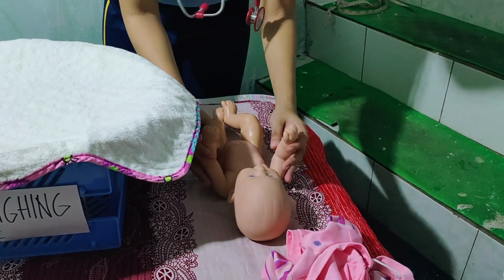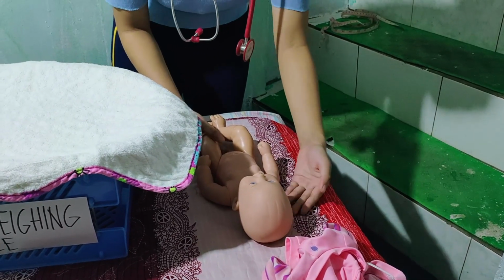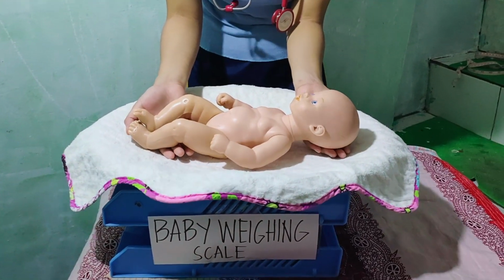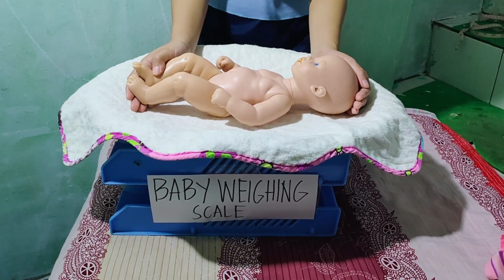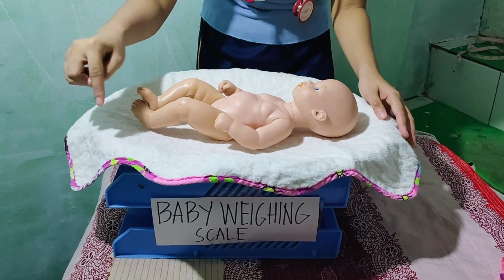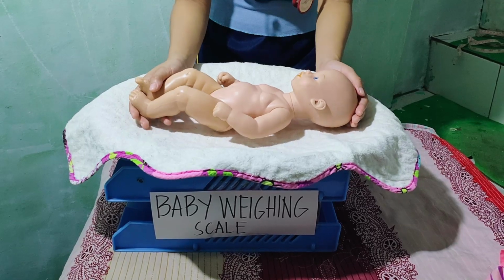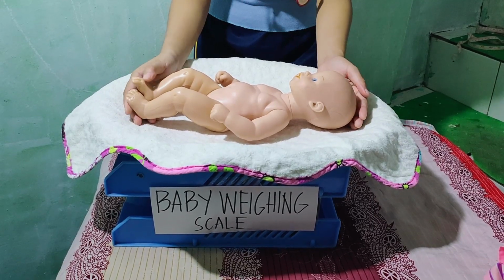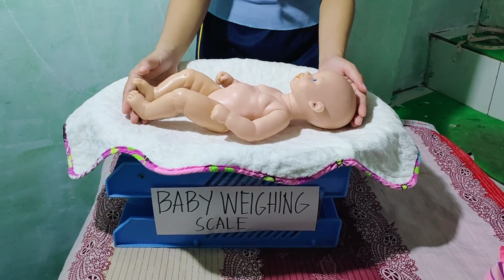So the baby is now naked. We must make sure that the baby is stable and calm and not crying. The baby weighing scale is digital. You must make sure that when you start, the scale reads 0.00 on the digital display. And then start weighing the baby. We will just pretend that the weight of the baby is 3 kilograms.